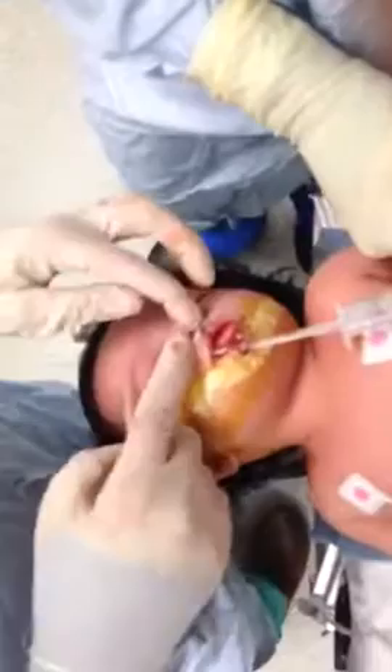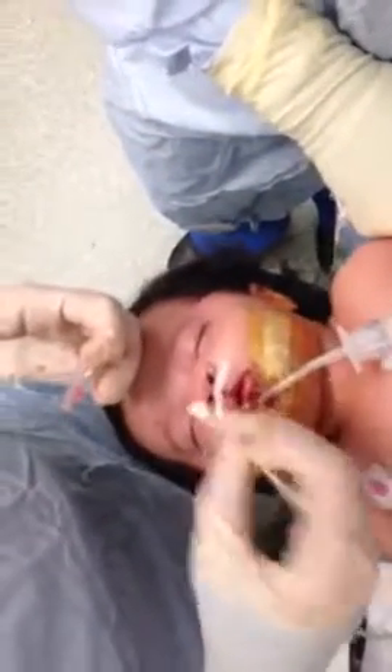Baby has a bilateral cleft. Obviously we're waking up from anesthesia here, but the nasal tubes should be removed, and the area cleaned gently with a Q-tip and water.